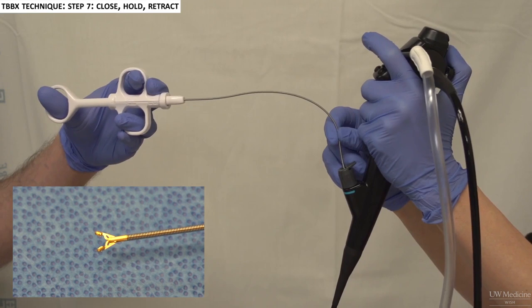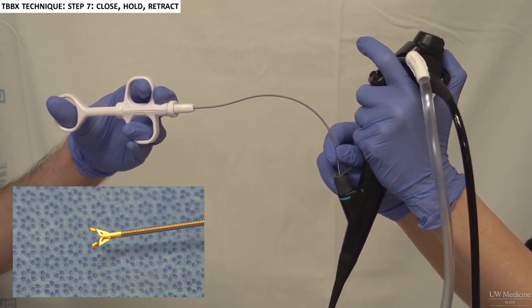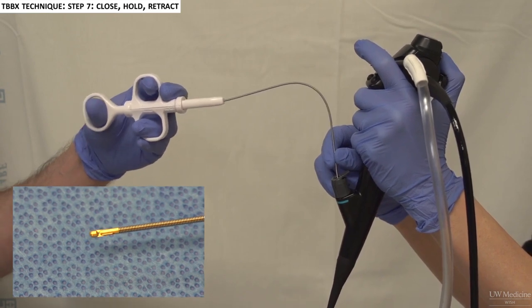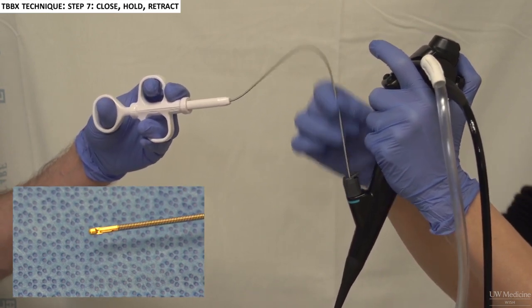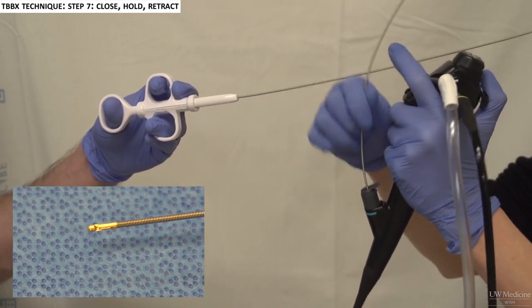During the final step, it is important to hold the forceps closed for a moment before retracting the forceps. This gives the forceps jaws time to fully close and cut the sample. Some providers take this moment to ask the patient if they have any chest pain.